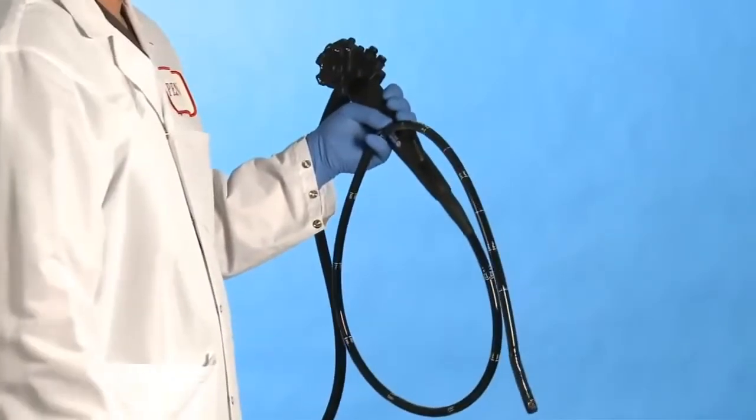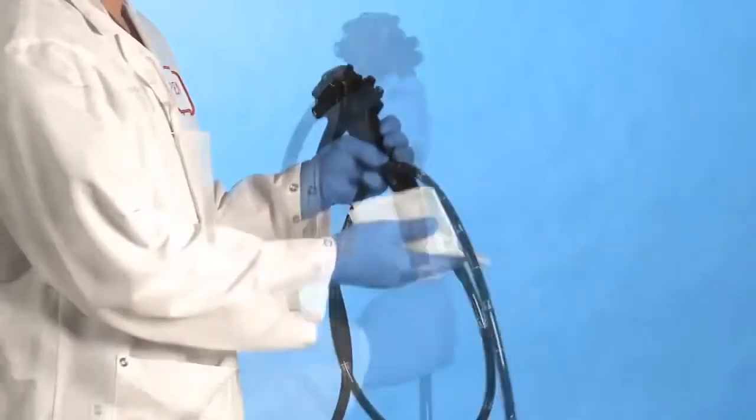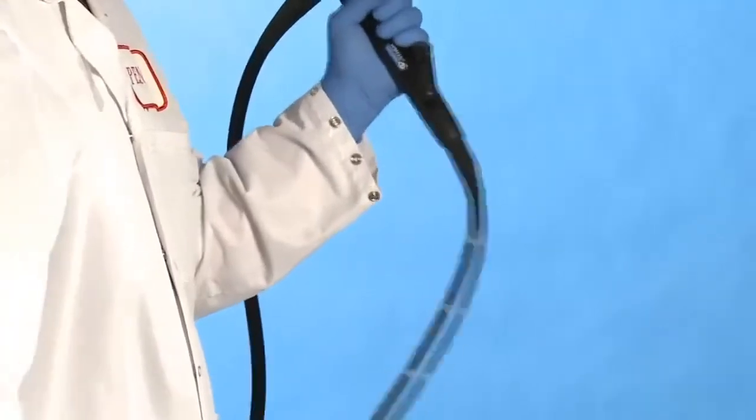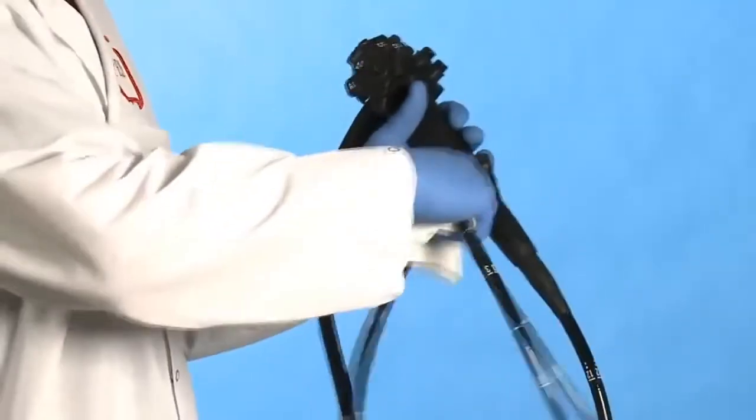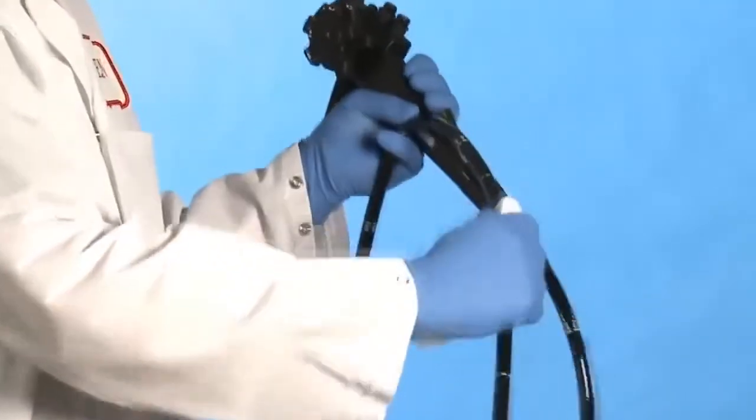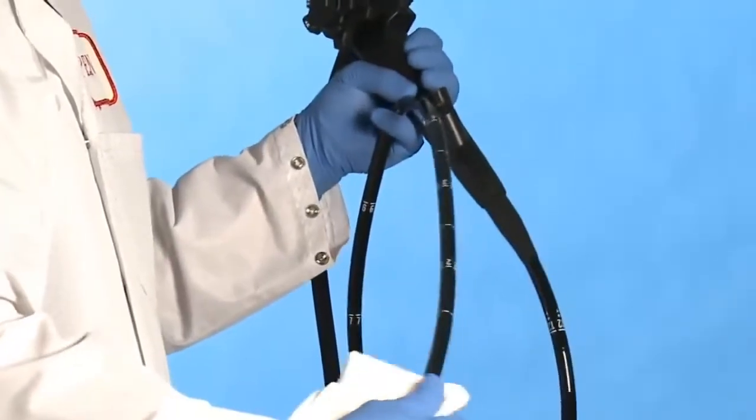Wipe in a downward motion from the control body root brace to the distal end of the endoscope. Do not pull the flexible tube through your hands in order to avoid potential impact damage to the distal end.